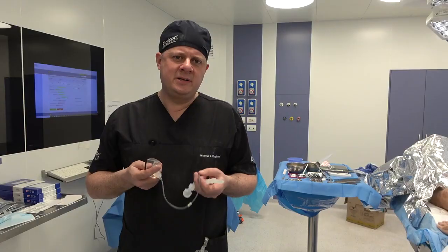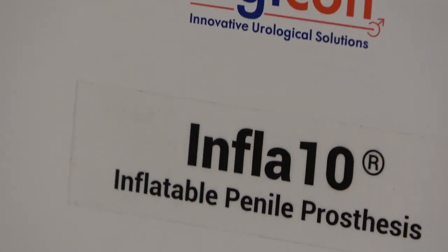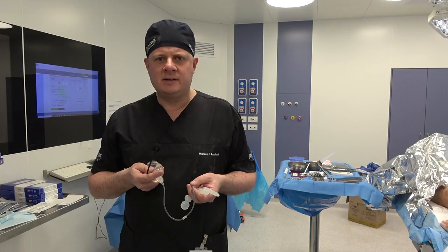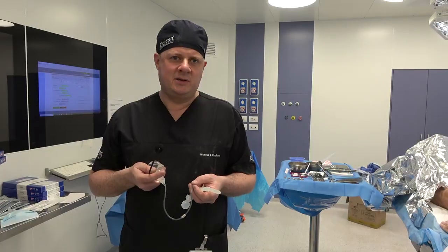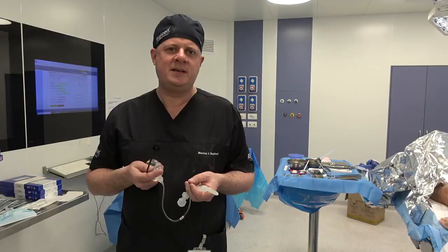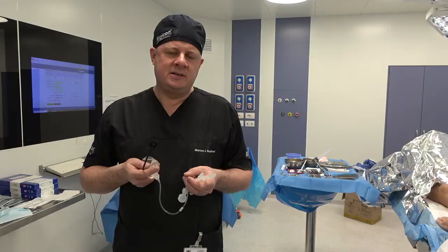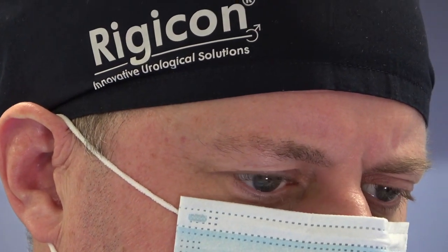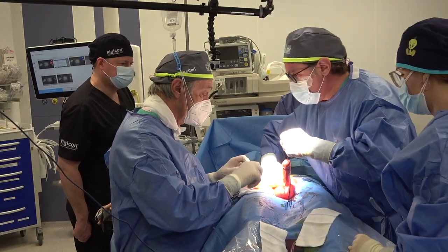Obviously compared with penoscrotal, it's very interesting for me to see this once again, as when we consider the number of infrapubic cases conducted versus penoscrotal, it's relatively few, certainly outside of the United States. But what is very noticeable to me is the very, very narrow cut that Professor Antonini makes and also the limited dilatation, which really minimizes the dissection into the corporal bodies.